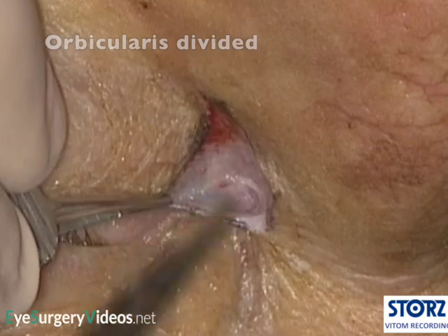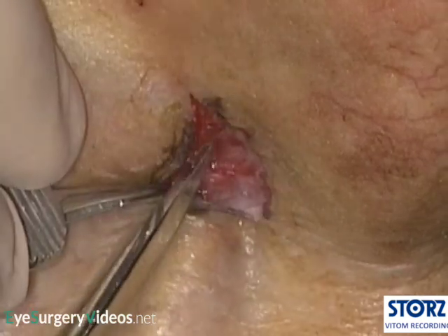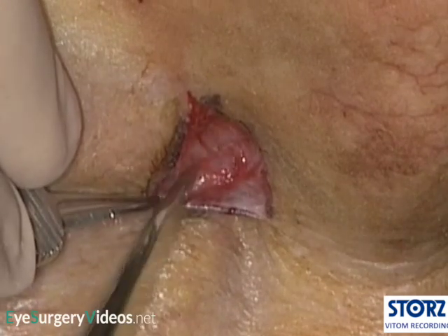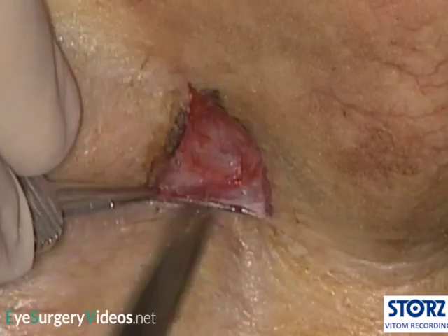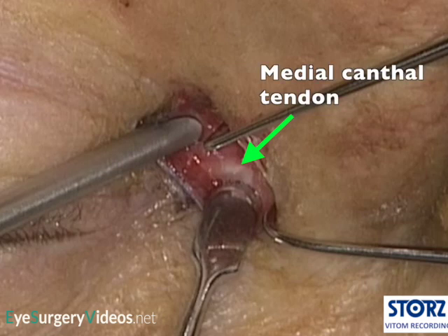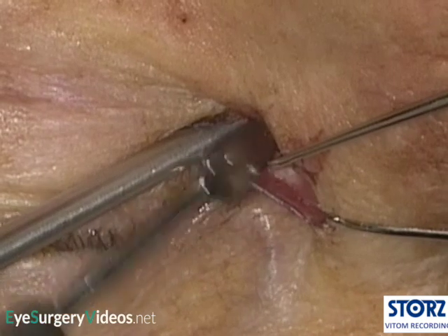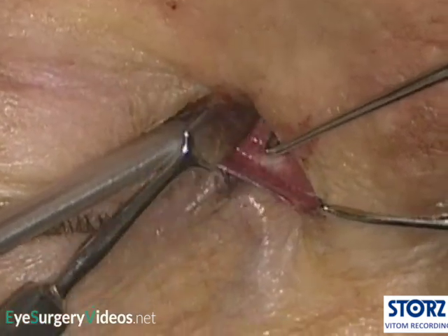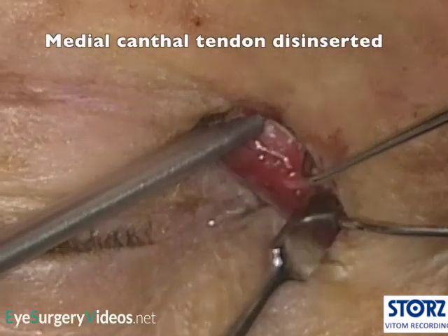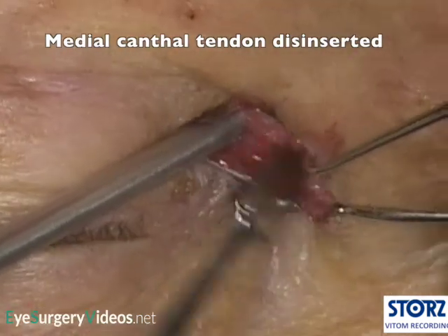Orbicularis is separated with blunt dissection. The angular vein is often seen and should be preserved if possible. The medial canthal ligament is an important landmark and is therefore useful to identify. It is disinserted to improve access to the lacrimal sac. It can also be transected, but disinsertion is probably preferable, as firstly, this will automatically create a useful opening in the periosteum, and secondly, may heal better postoperatively.